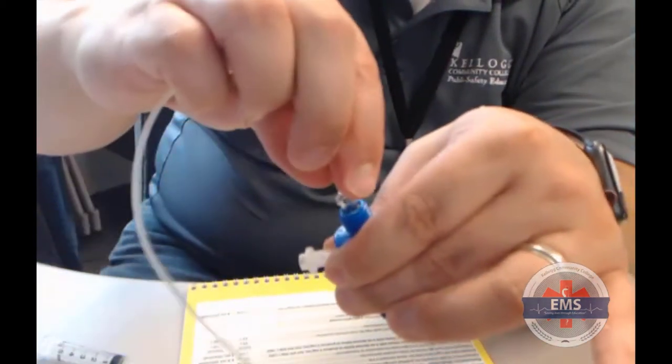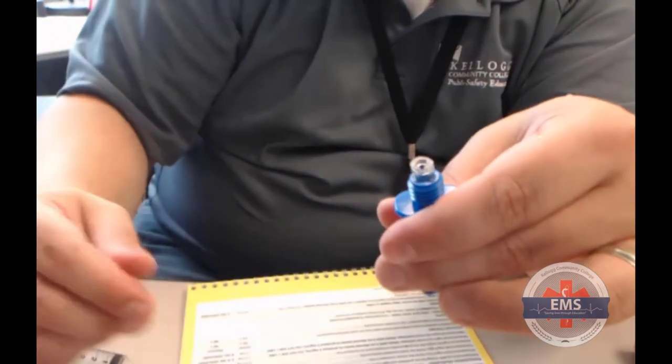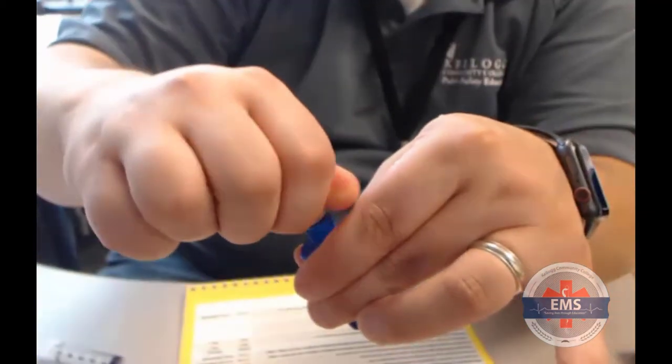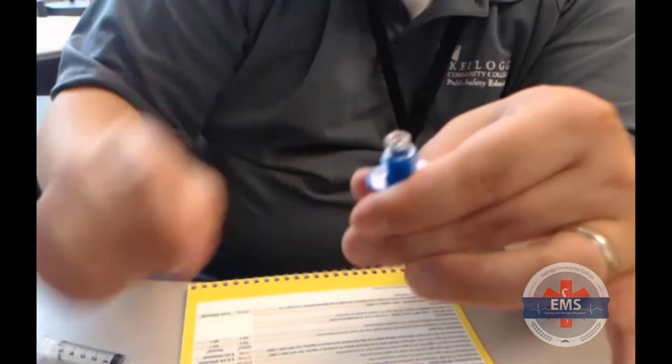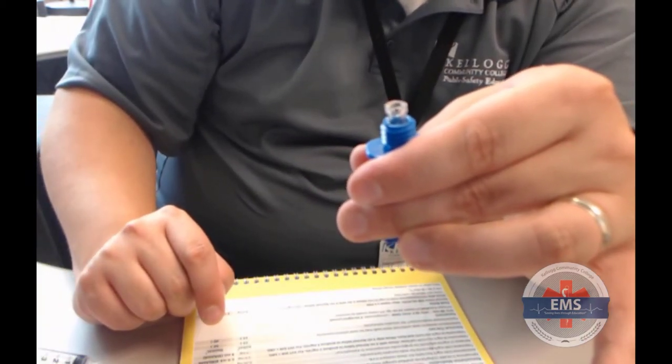Or I can just actually hook up my line directly to it that way. Regardless of the route you're going to take, it's definitely important that we keep these areas clean and cap them as regularly as we can to help prevent any infection.